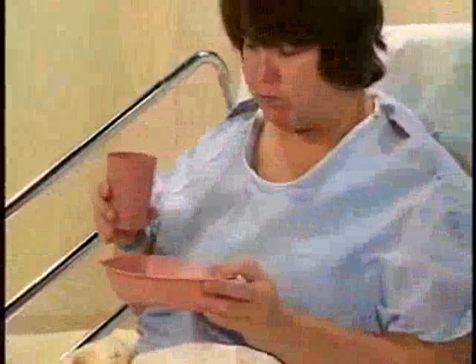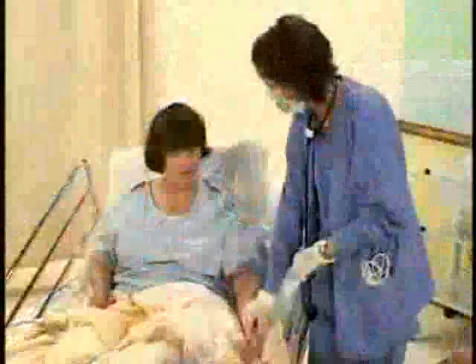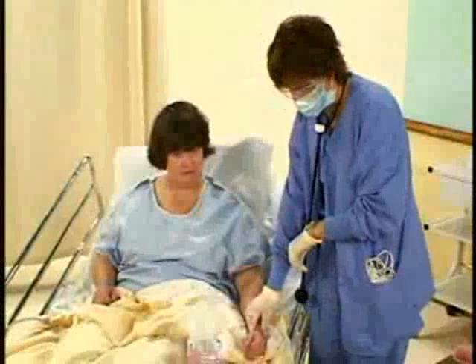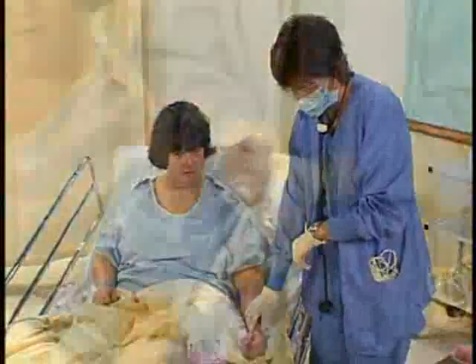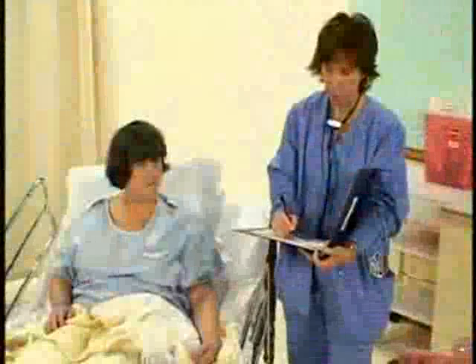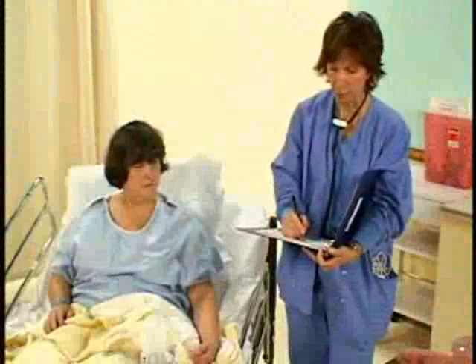After the treatment, offer the client a mouth rinse with warm water or saline. Reassess the client 5 to 10 minutes following the treatment, as some effects may be delayed. Dispose of your gloves and mask, if used, and wash your hands. Record the medications administered on the medication record and record the assessment data.